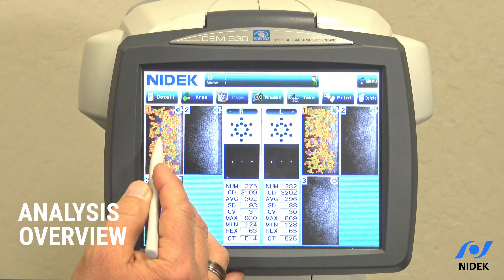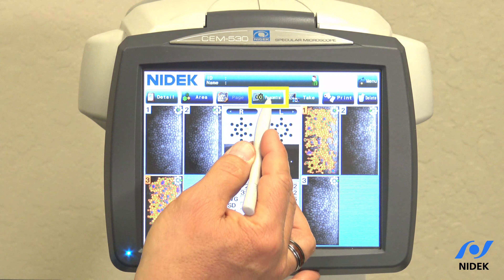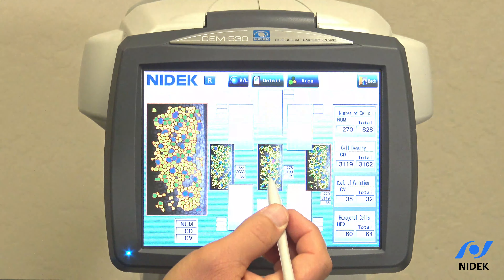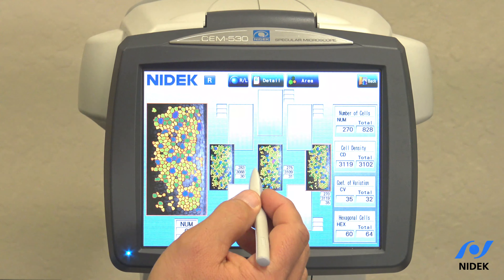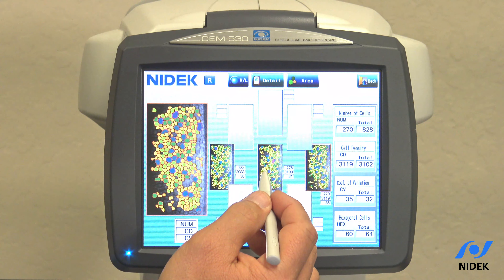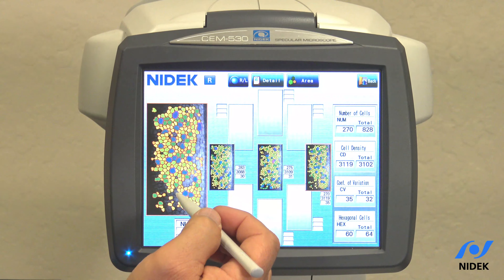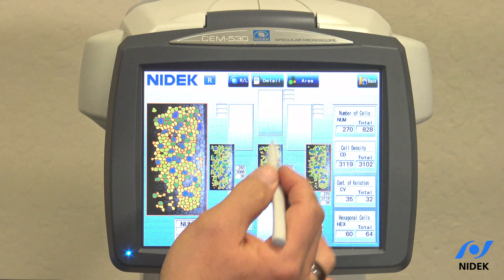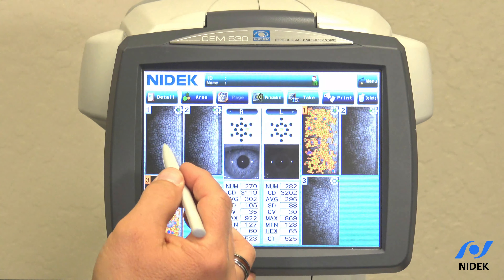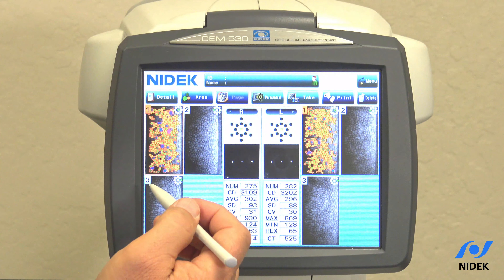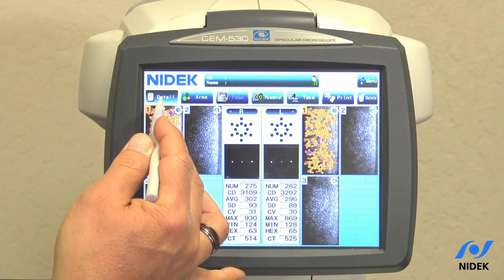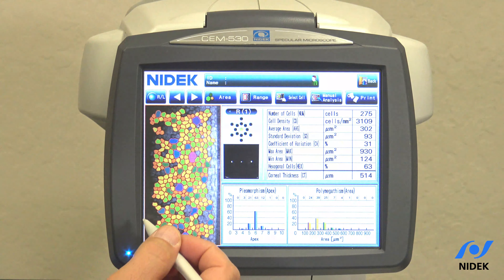You can see the green dot here. If you would like to view this in paracentral mode, as you can see here, this is our center and then our paracentral imaging. Each one of these can be viewed over here on the left. If I go back and select the image that I would like to look at in more detail, we select details.